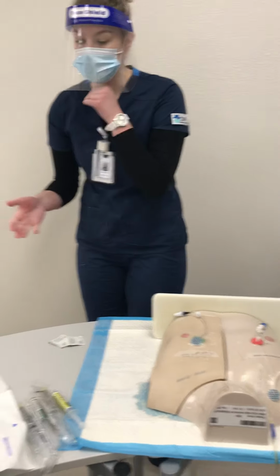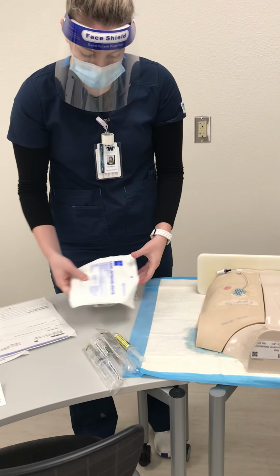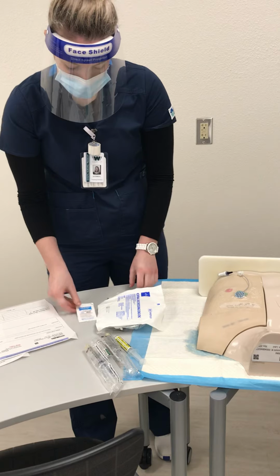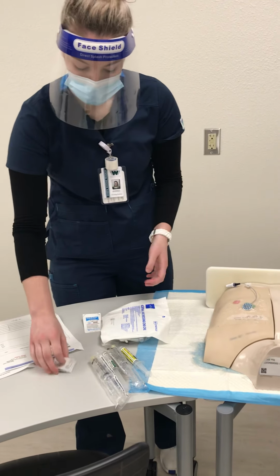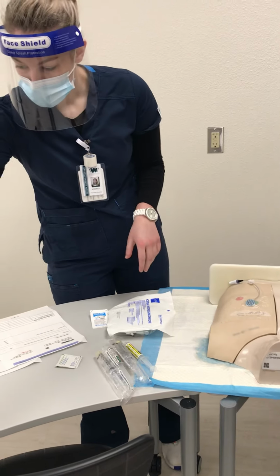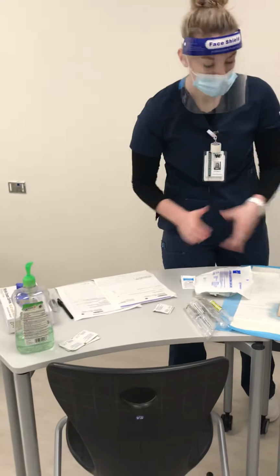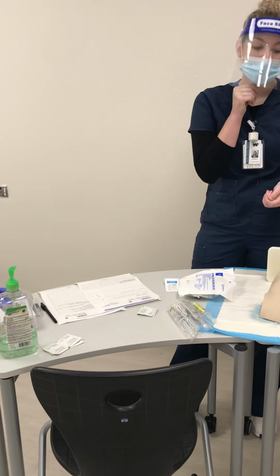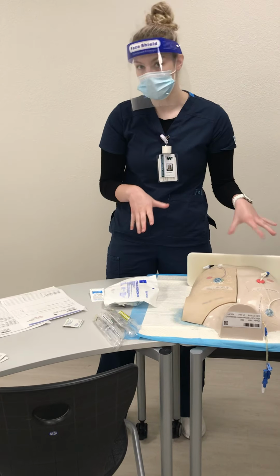and perform hand hygiene. And then I also have a dressing change for Mr. Chest, so I've brought that in the room with me here. My sterile kit, as well as some things that I'm going to have to add into the kit as well. So I'm going to perform my hand hygiene, and I verified again that I need to change the dressing, as on this label it says that it was changed 7 days ago. So we're okay to change that, and I haven't left the room, so I would verify my patient one more time just to be safe.